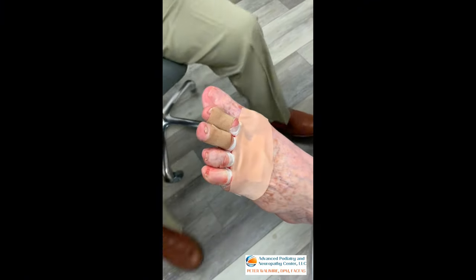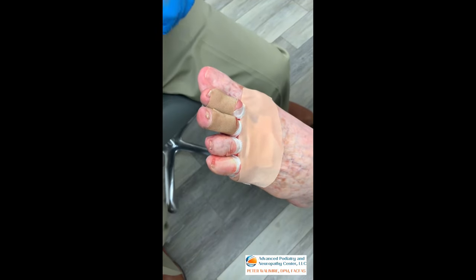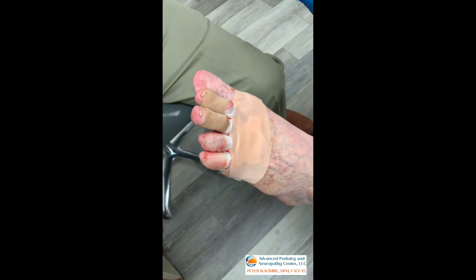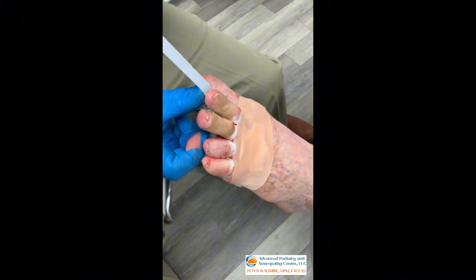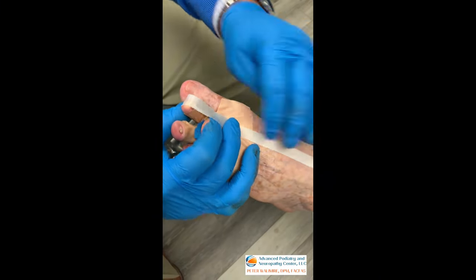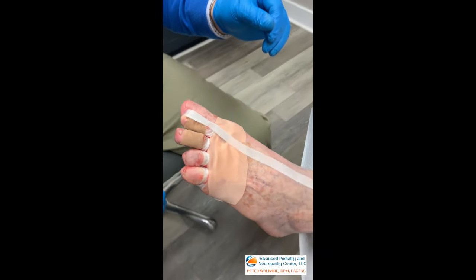The final step is stretching the toe out with another long piece of tape about eight inches long. We tape from the tip of the toe right under the tip, stretch that toe up, and then tape to the top of the foot. You can see the significant improvement once we get the tape on.